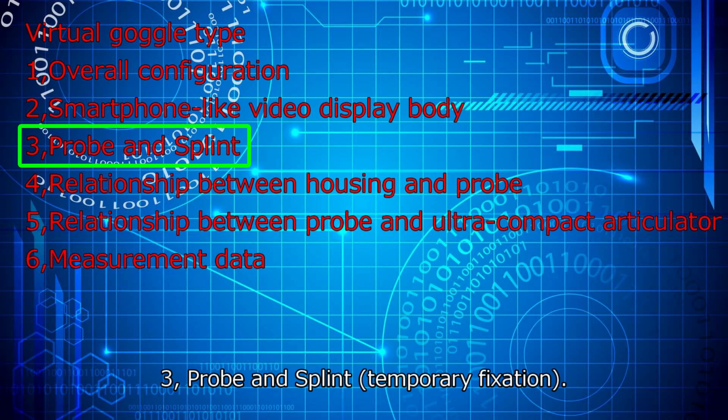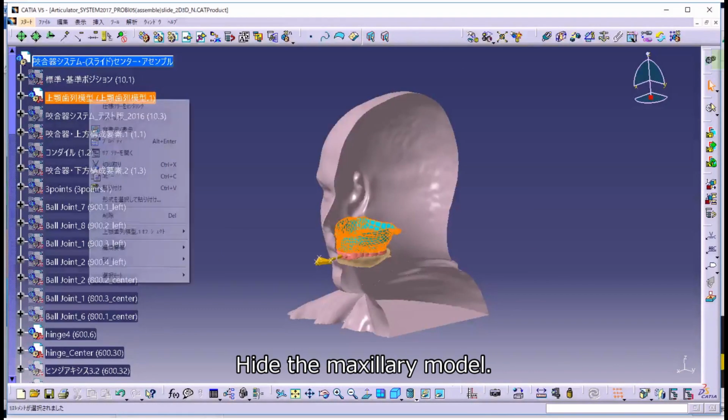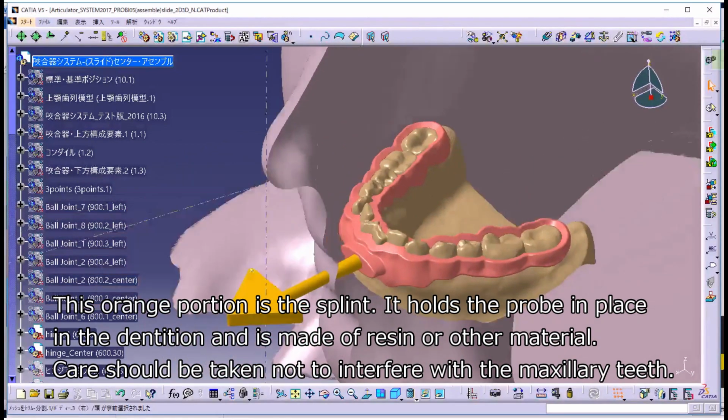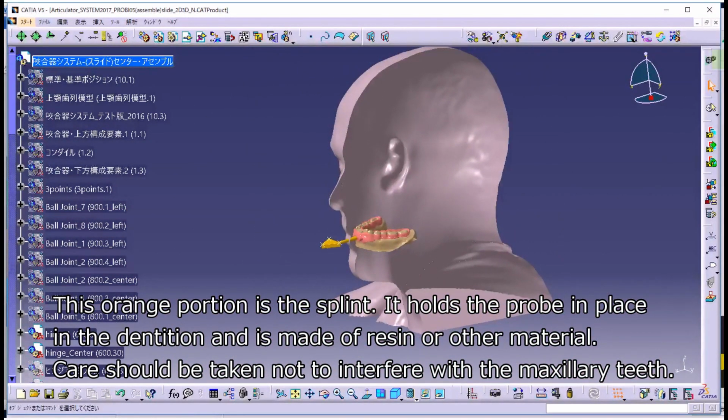3. Probe and splint. Temporary fixation. Hide the left half of the head. Hide the maxillary model. This orange portion is the splint. It holds the probe in place in the dentition and is made of resin or other material. Care should be taken not to interfere with the maxillary teeth.